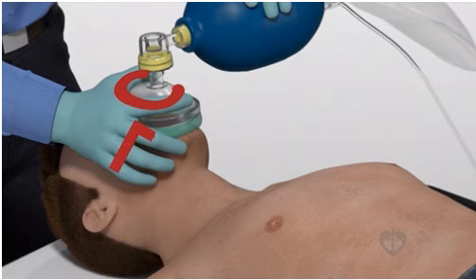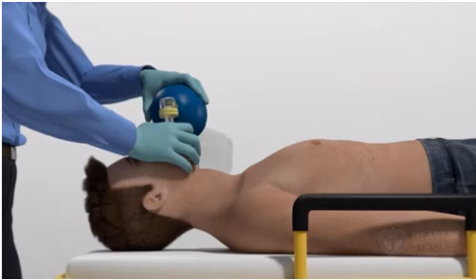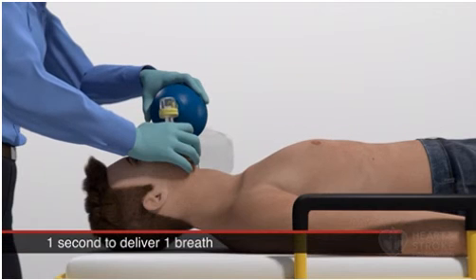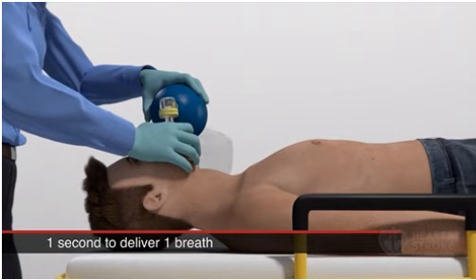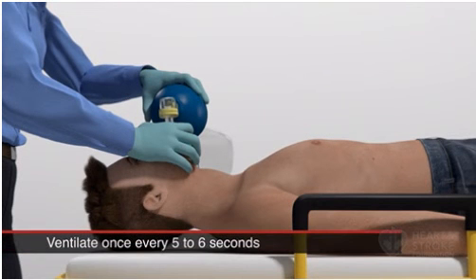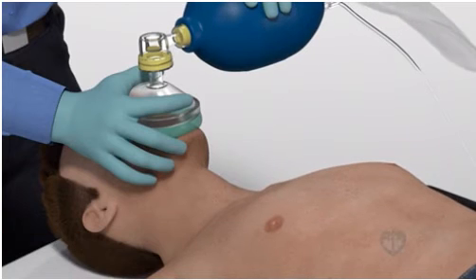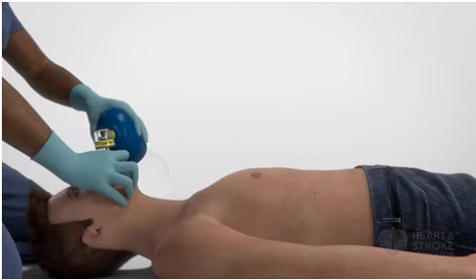At the same time, the three remaining fingers form an E and should be used to lift the jaw, opening the airway. While maintaining a tight seal between the patient's face and the mask and maintaining a jaw lift to open the airway, the provider should squeeze the bag, taking about 1 second to deliver one breath. For a patient who has spontaneous circulation but needs ventilatory support, the provider should give rescue breaths at a rate of 1 breath every 5 to 6 seconds. An effective breath results in visible chest rise.